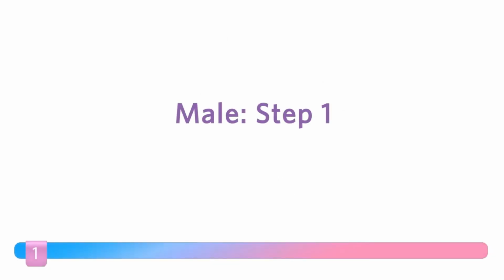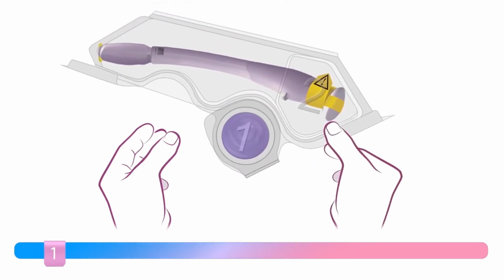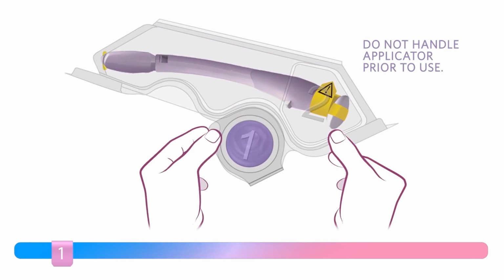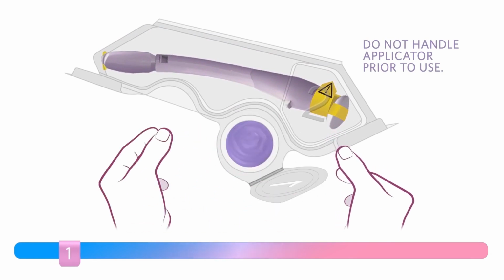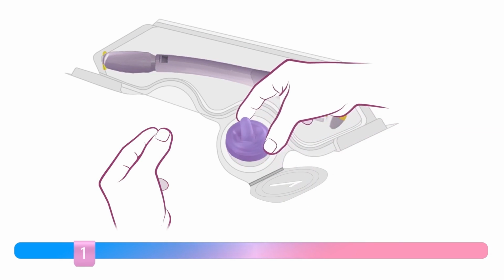Step 1. Wash your hands thoroughly. Remove the conceptacle from the package. Do not use fingernails or anything that can damage the conceptacle.